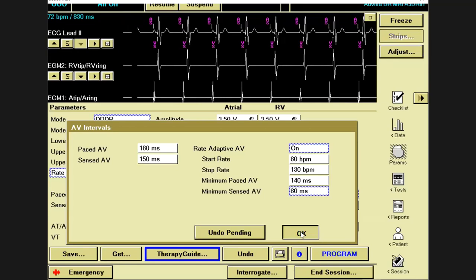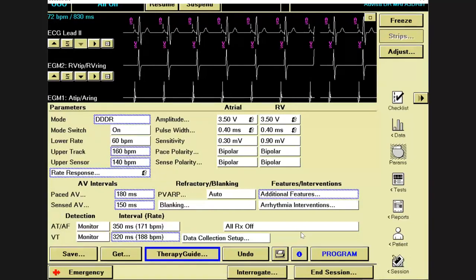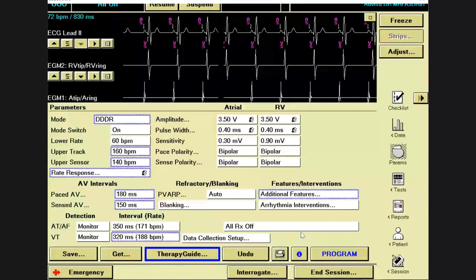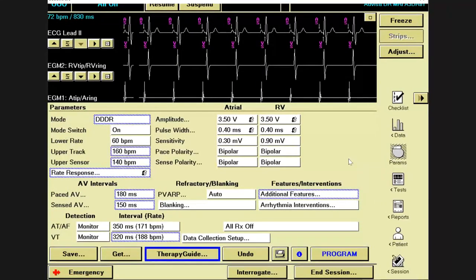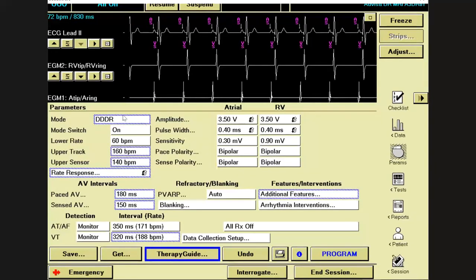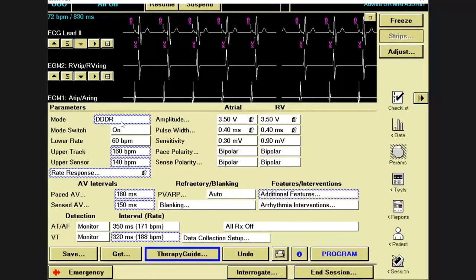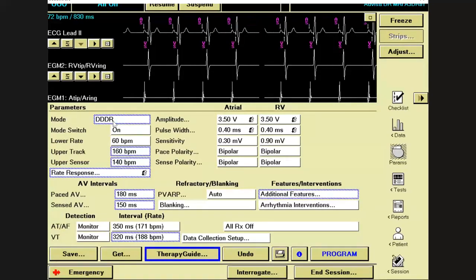Govindu. Yes, sir. There are some situations in sick sinus syndrome where the intrinsic sinus rate is low. Most of the time the patient's sinus rate lies between 50 and 60. It can go up, but most of the time it stays there, and in that situation, usually the patient is paced. In that situation, what will be the ideal approach? What will be the lower rate? What will the paced AV delay be? And how can we avoid ventricular pacing?